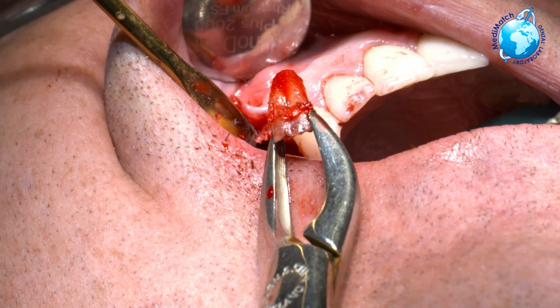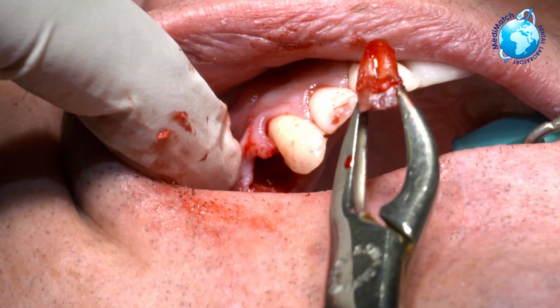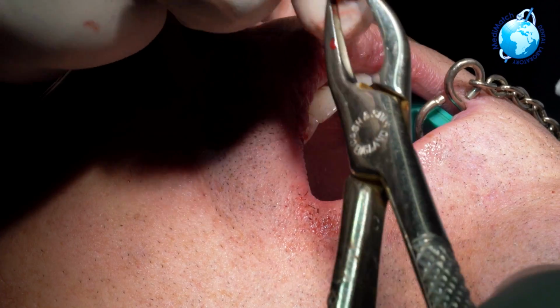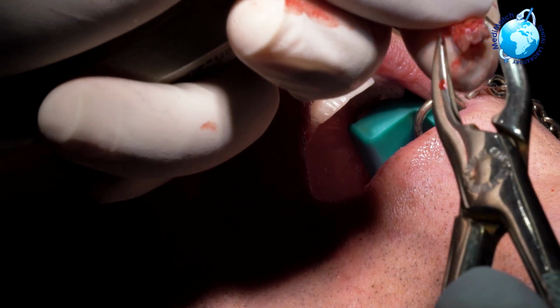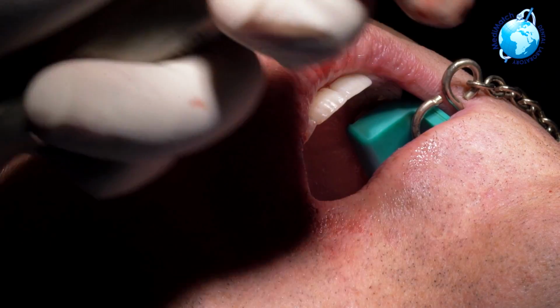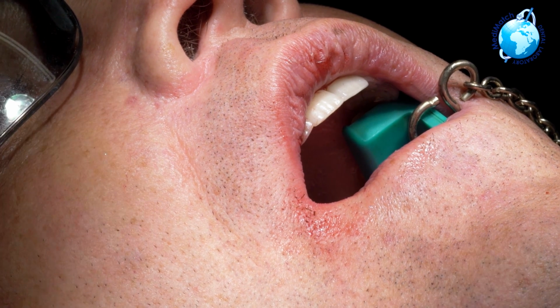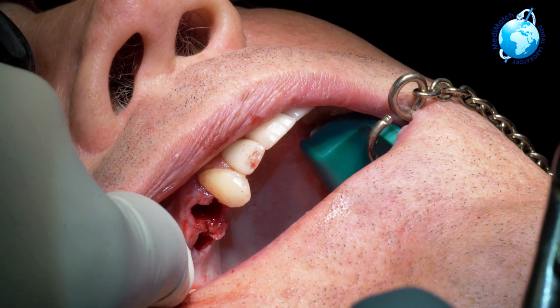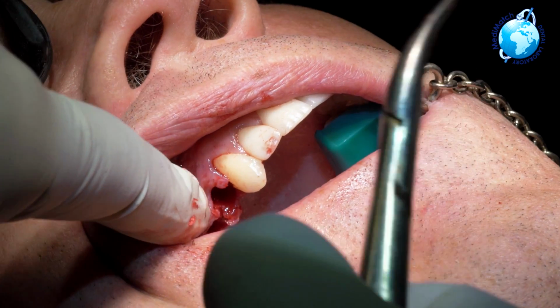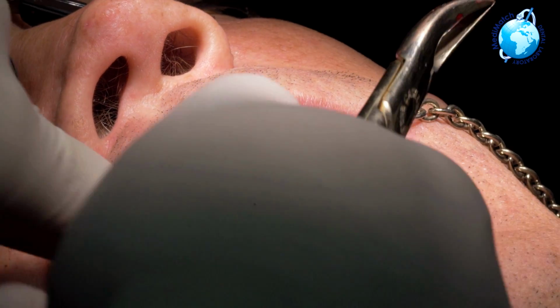Can you see that? Typically the difficulty of these sort of extractions is when you've got a very heavily root-filled premolar tooth. Obviously it just cracks, there's not enough structural integrity to really grab hold of. So you just need time and patience. So what we're going to do now, we've kept all the buccal plate, everything intact here, so we're going to get the patient ready for an implant to be placed in the front area and a sinus lift going in the back there.